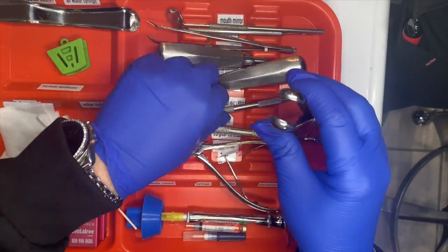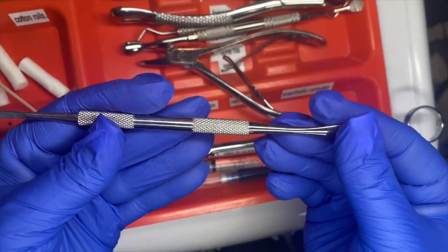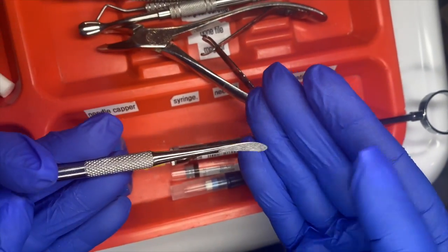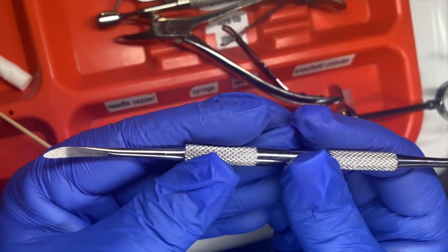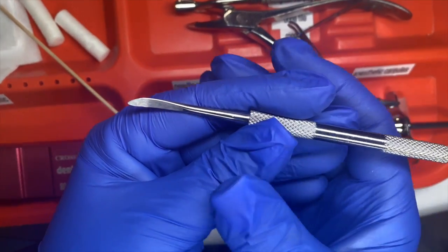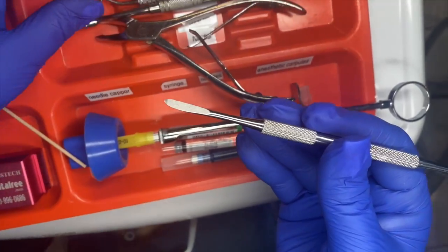We can use the periosteal elevator next. This one is good for retraction — this side can hold back tissue and release and remove the periosteum from the tissue of the tooth. It is the connective tissue around the neck of the tooth and just helps open everything out and get it loose for the doctor.